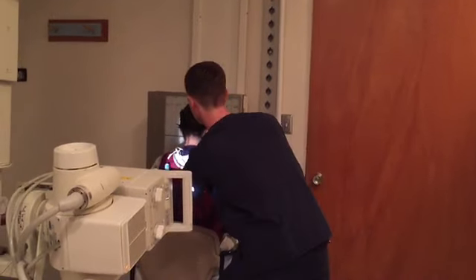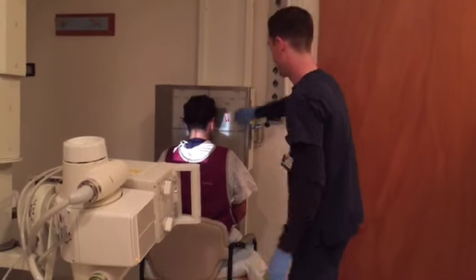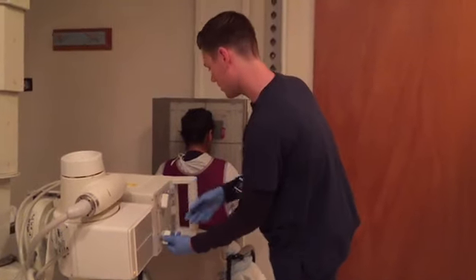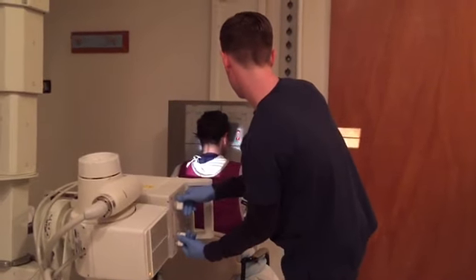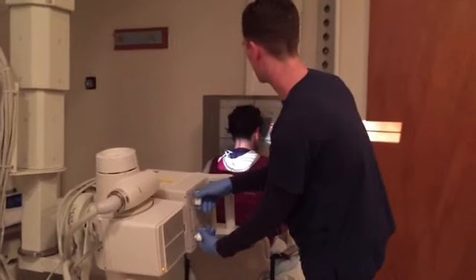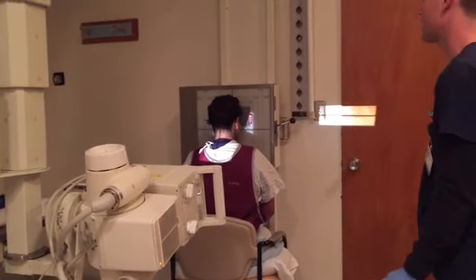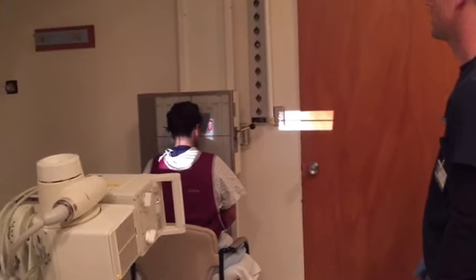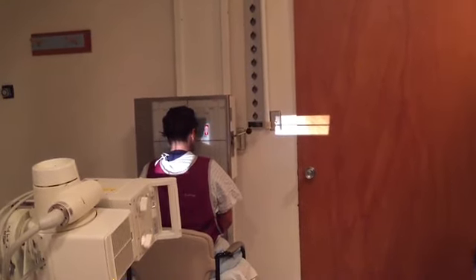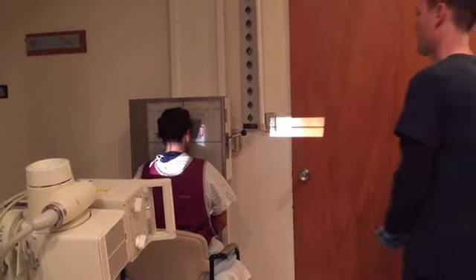Make sure we're centered. Move to your left a little bit. Right there. Perfect. Okay. Place my right marker. I'm going to collimate down a little bit. We want to get just the mandible in there. Okay, on this one, I'm probably going to shoot a technique of about 75 kV at about 12 mAs. Okay, Evelyn, go ahead and hold your breath. Don't move. Expose. Okay, go ahead and breathe.